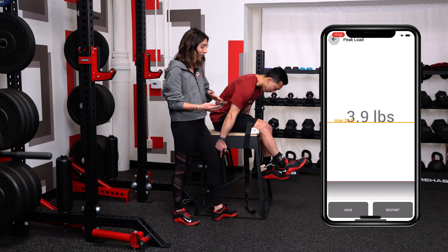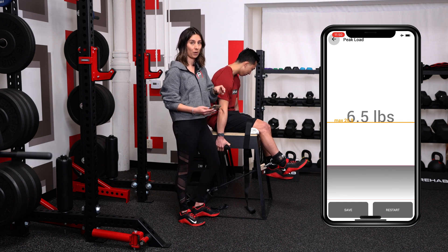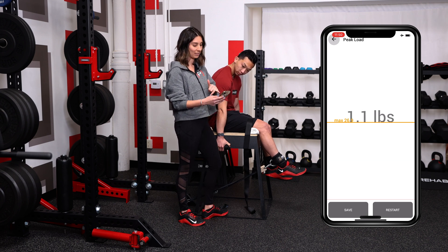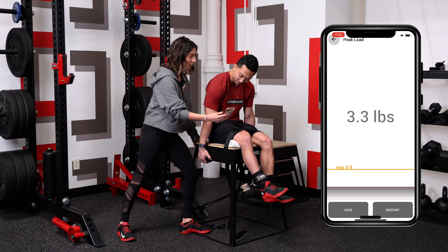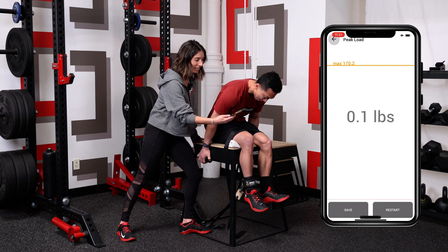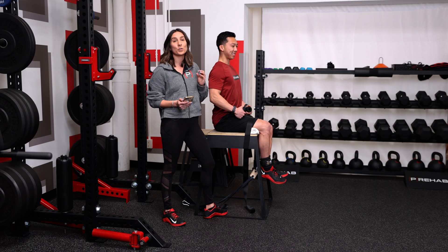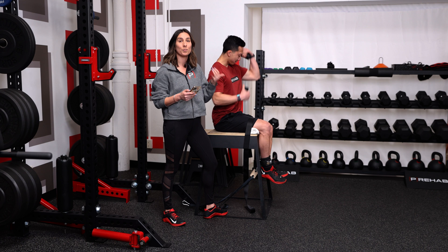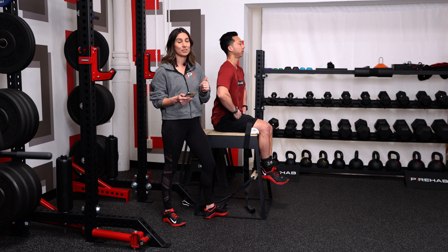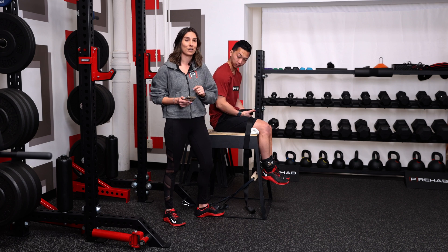Mike is ready for his max effort quad kick at 60 degrees. I'll give him a three-second countdown and he gets about five seconds to develop as much force as possible, which allows more time for maximal motor unit recruitment and muscle fiber activation — you can't tap into everything in that first second. On the count of three, two, and go — and rest. Nice, 170.2 pounds. That was the 60-degree quad result.